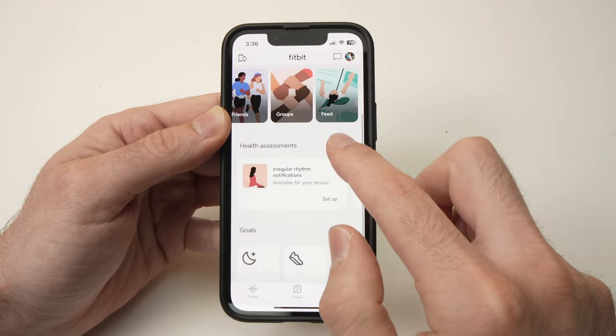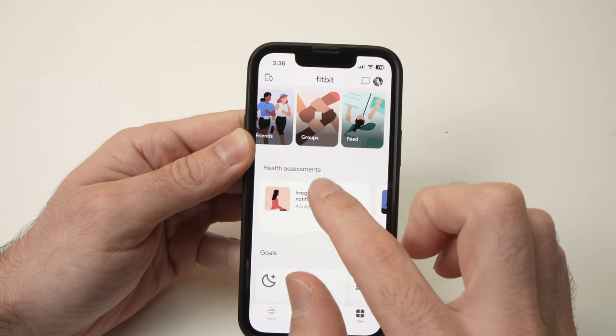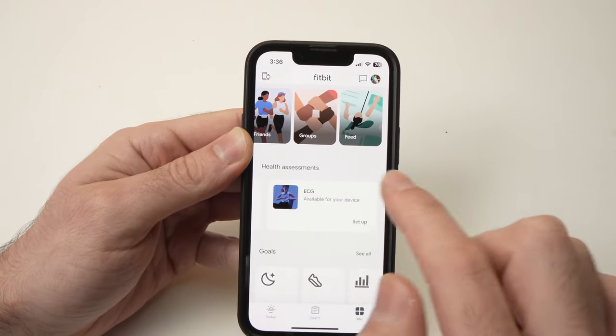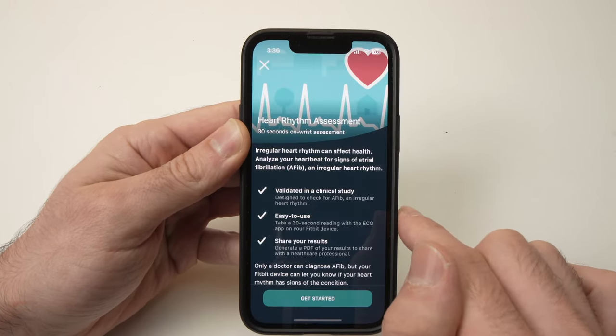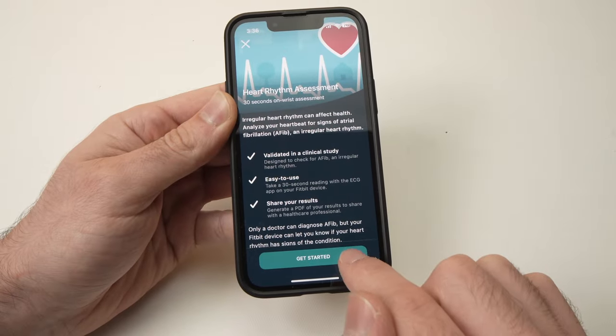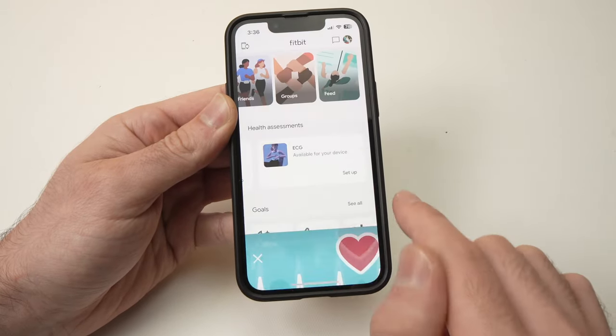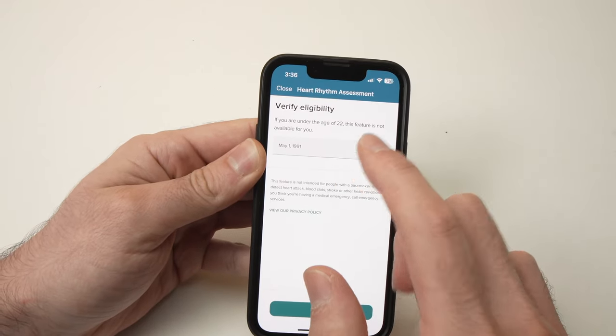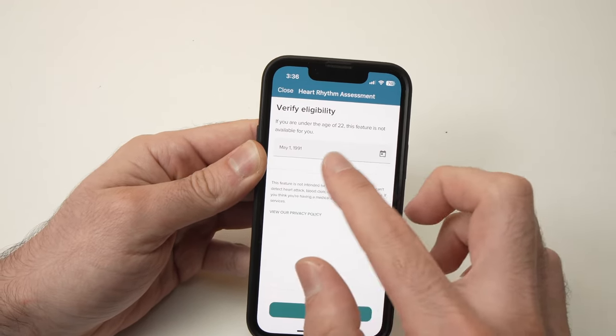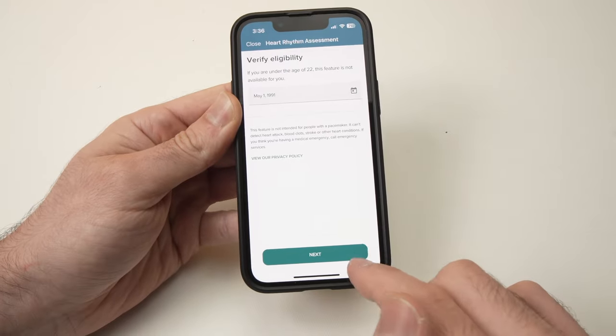Go down and under Health Assessments, swipe once and you should see ECG and a setup button. Press on Setup, then press Get Started. From here you'll need to input your birth date and then press Next.